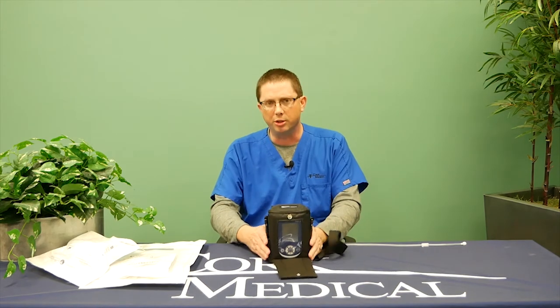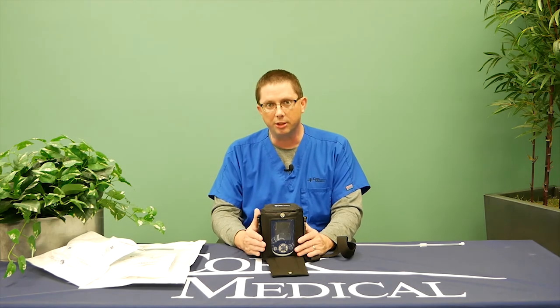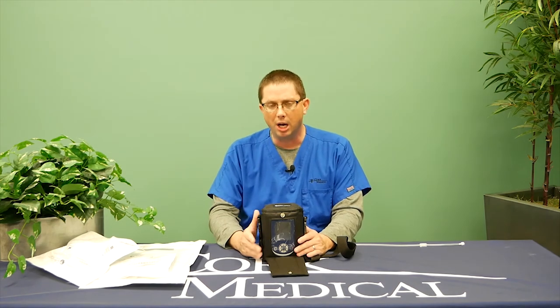Another common question: is it normal for the pump to sound like it's turning on and off? That is 100% normal. The pump will turn on and off — what that means is you'll hear a little vibration as it re-pressurizes your wound to keep it in appropriate settings.